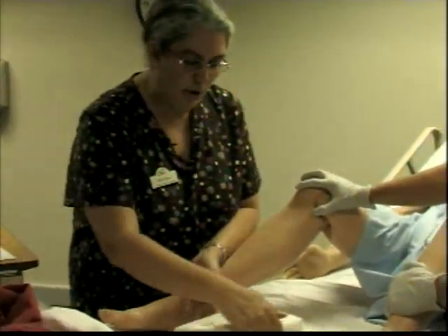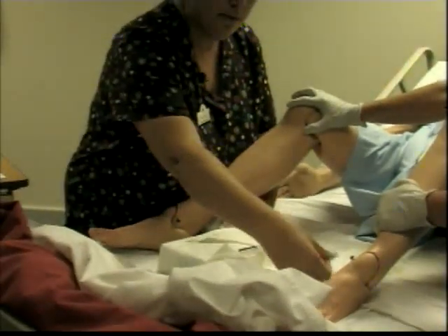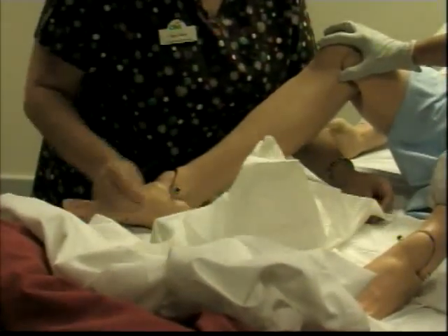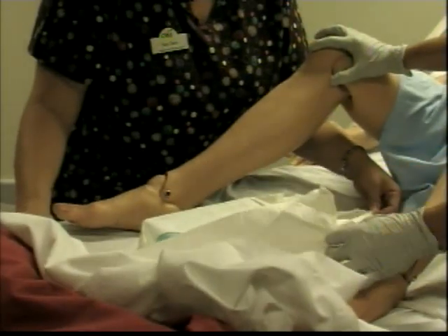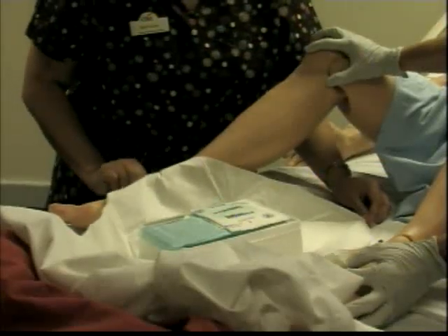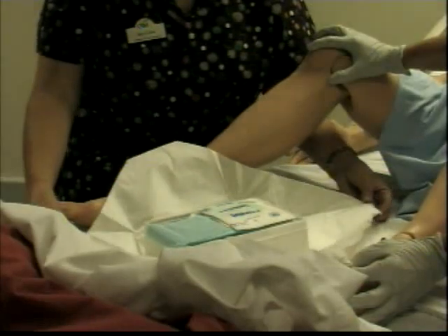How do you open a package? Review from Nursing 1115: you open this part away from you, then side to side, then towards you. This is going to be specifically challenging. You can ask your assistant to help you maintain the inch border.